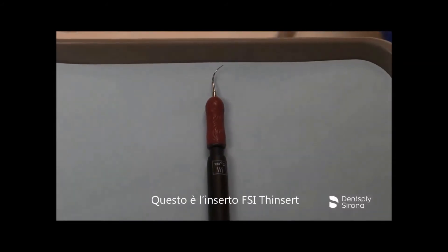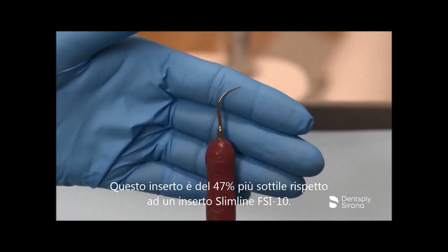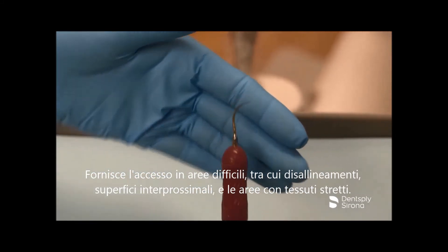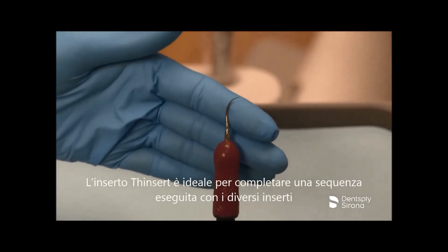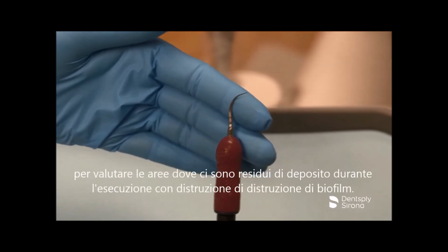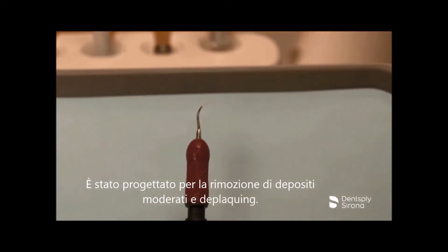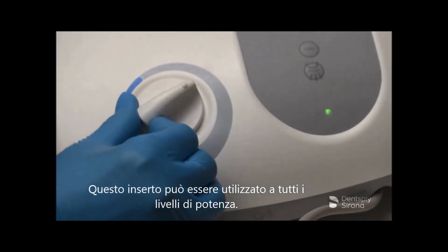This is the Cavitron FSI Thinsert. This insert is 47% thinner than the Cavitron FSI Slimline 10. It provides access in difficult areas including misalignments, interproximal surfaces, and areas of tight tissue. The Cavitron FSI Thinsert is ideal for completion of a staged instrumentation sequence to assess the areas for remaining deposit while performing thorough biofilm disruption. It is designed for removal of light to moderate calculus and deplaquing and can be used at all power levels.